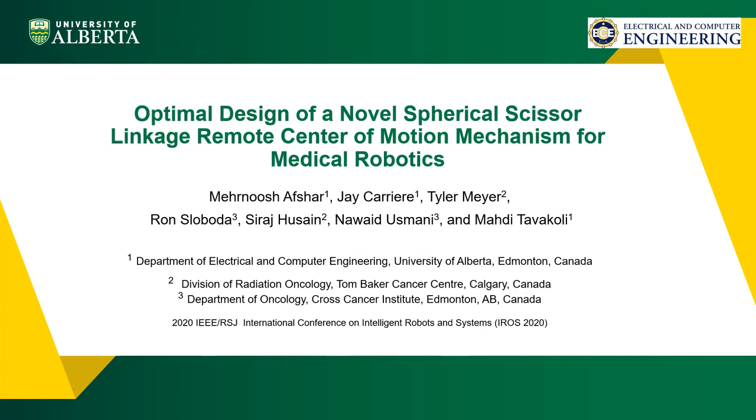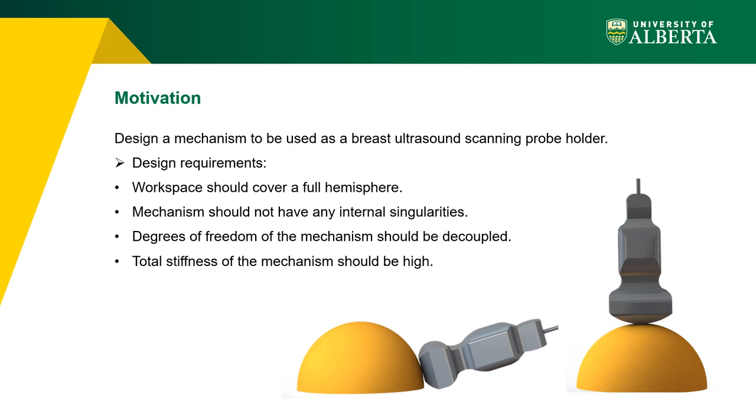This work presents the optimal design of a spherical scissor linkage remote center of motion mechanism for medical robotics. The objective is to design a mechanism that can be used as an ultrasound probe holder for breast examination. In this procedure, we need to access the whole surface of the breast, so theoretically we need the mechanism to have a full hemisphere as its workspace.